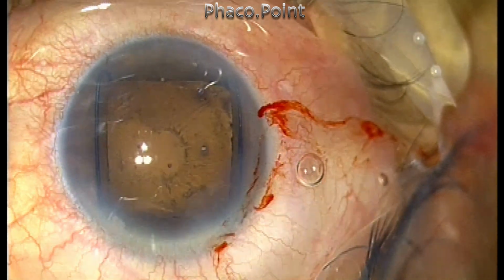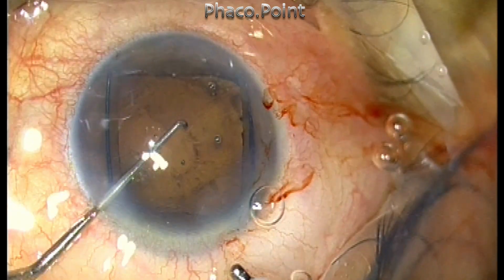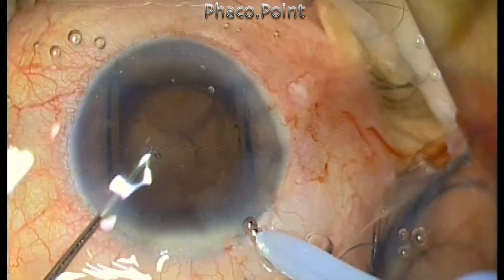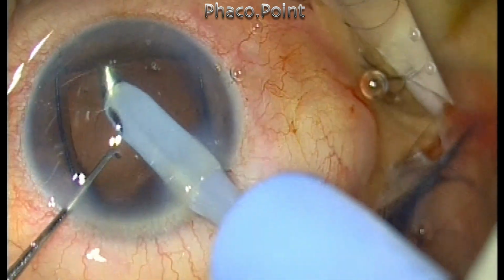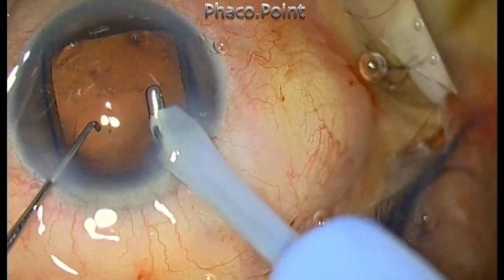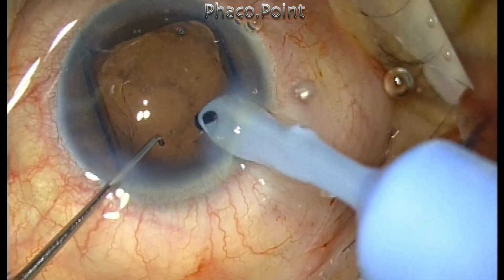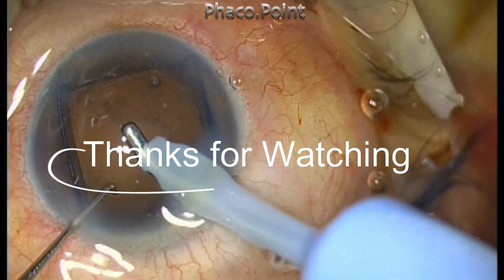Once the CTR goes inside the capsular bag, this gives a horizontal stretch to the equator of the capsular bag, and then the capsular bag behaves itself, the trampolining will stop, and it will be so much easier for you to access the peripheral recesses of the capsular bag and remove all the cortical matter safely and soundly. Thank you for your attention.